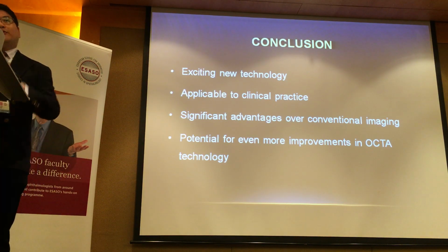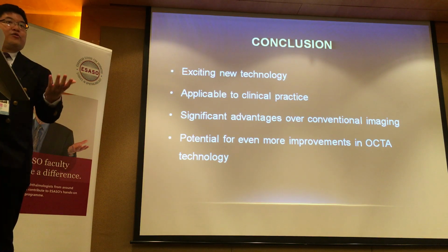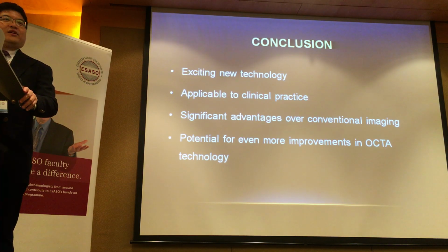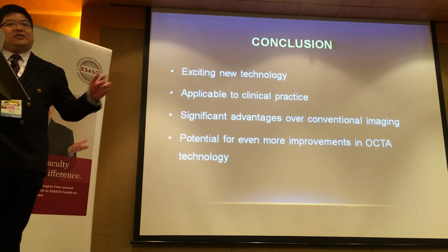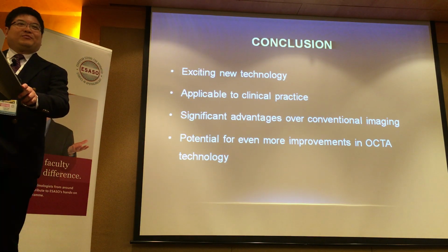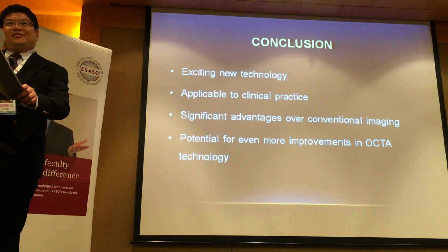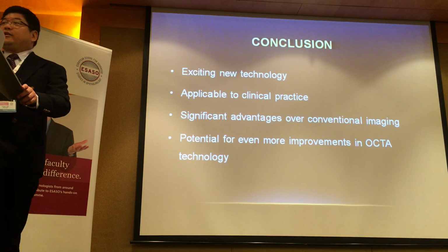You bring up a good point as well, that some people have done OCT angiograms on dry AMD, and they pick up lesions. Of course, some of them will say, well, tada, this picks up something new that I missed. But are you going to treat them? Usually when that question comes, it's not a very straight answer after that. And I think it's a real thing.